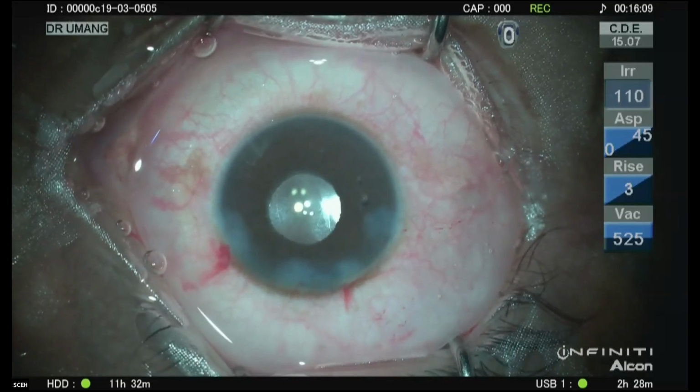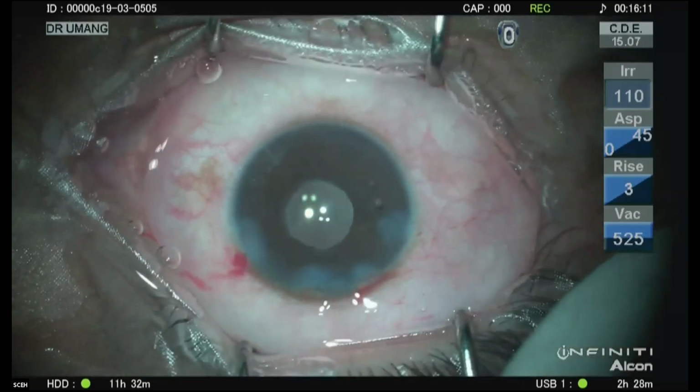Okay. Pretty good. So Dr. Sridhar Goli is asking, if inadequate cracking is done, how should we continue? Can we continue further or not?